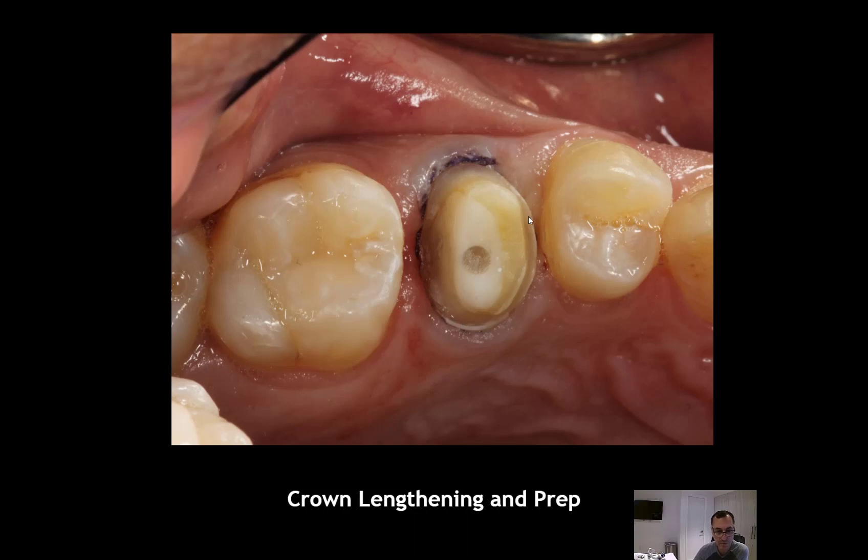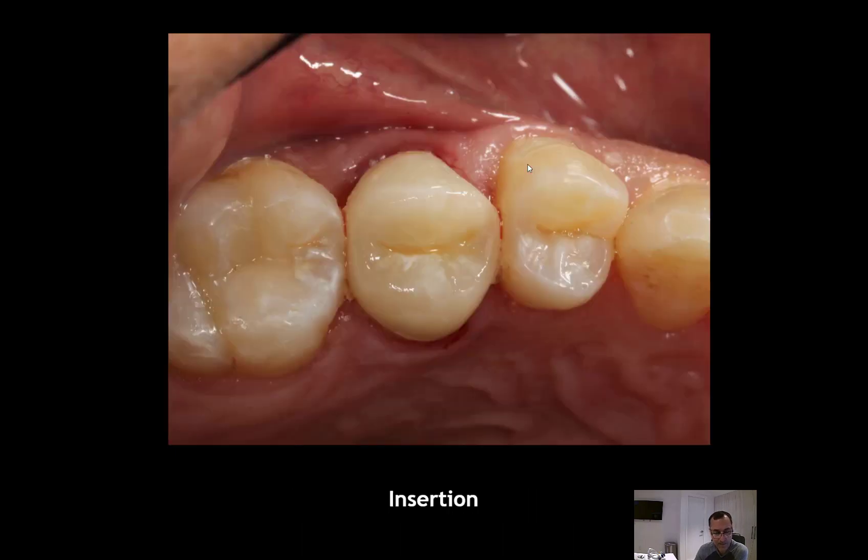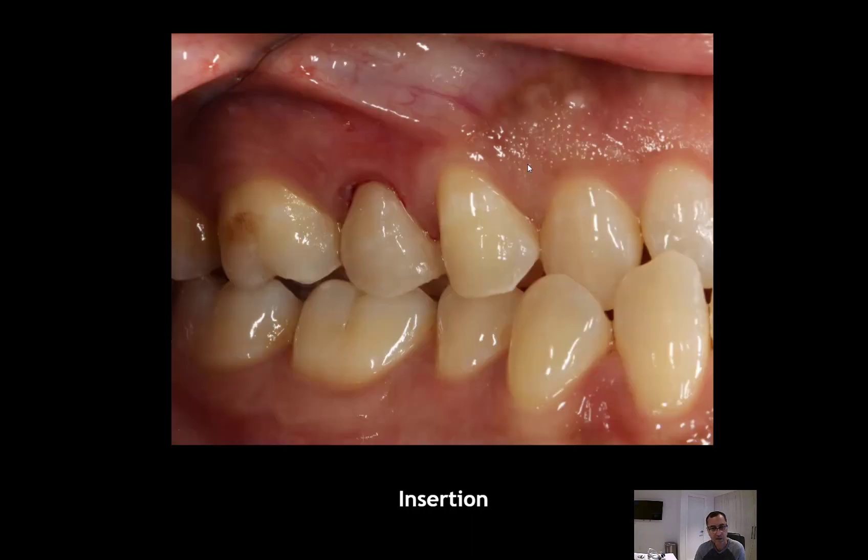When we're done, you can see the post has been placed, crown lengthening was completed, and the distal margin is already at the gingival level. I placed cord to expose the margin, then the tooth was prepped and scanned with the Cerec — I think I used the Omnicam at that time — and we designed the crown in the office. On the day of insertion I used eMax A3LT, and you can see the result on the day of insertion.